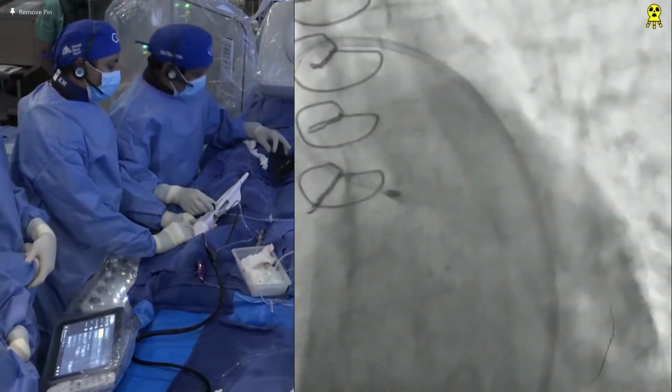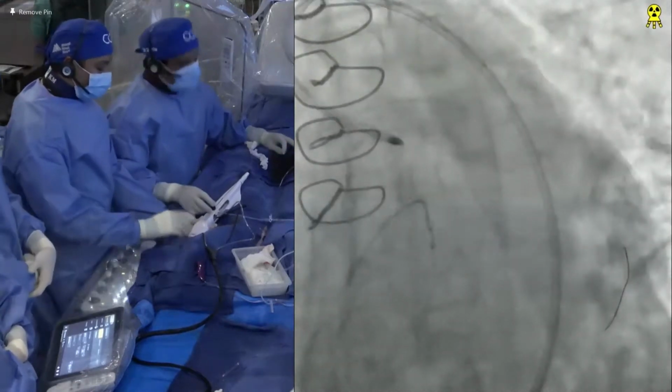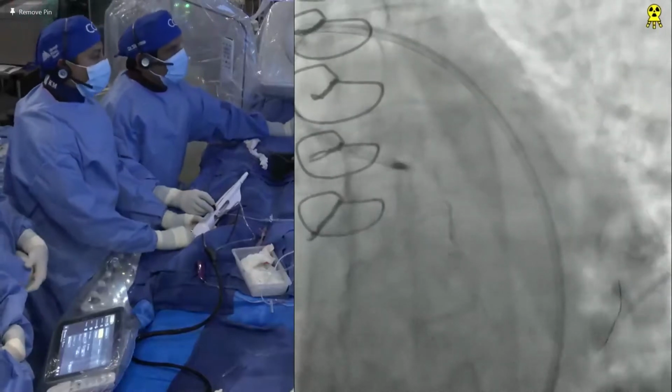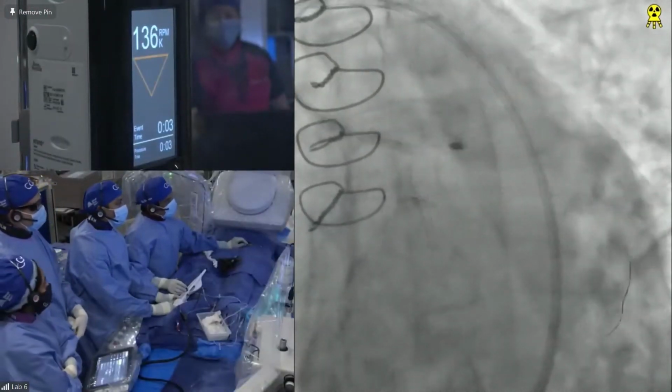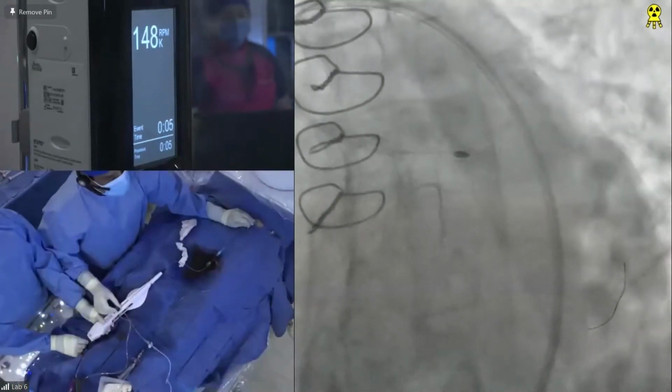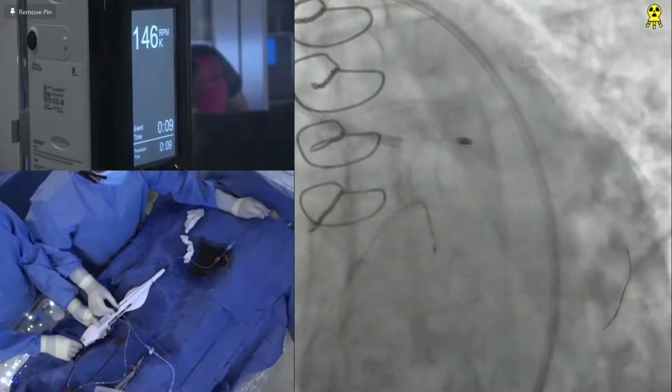At the level of the Y connector, and a tap on the Dynaglide, nothing happened. Now we are ready with a 2.15 burr. How did the 2.0 burr go when you were going with the 2.0? Okay. It was a little tough. It took us about 4 runs. Each run is about 20 seconds.